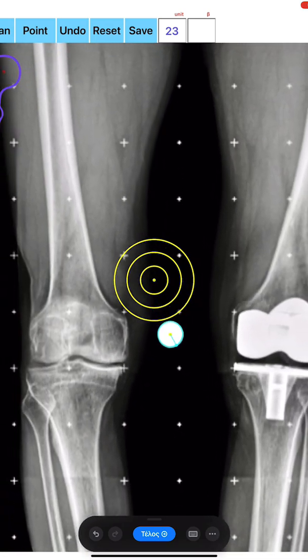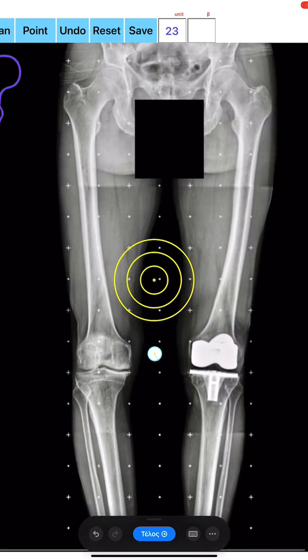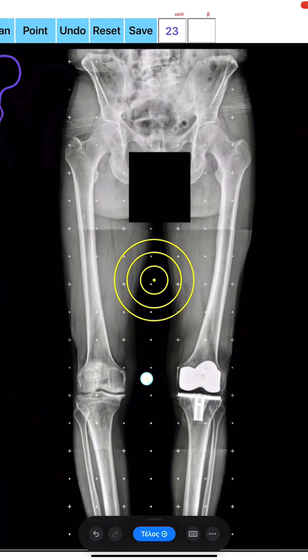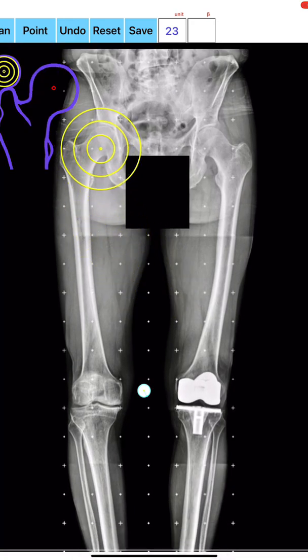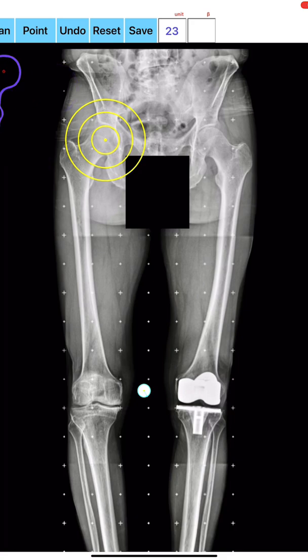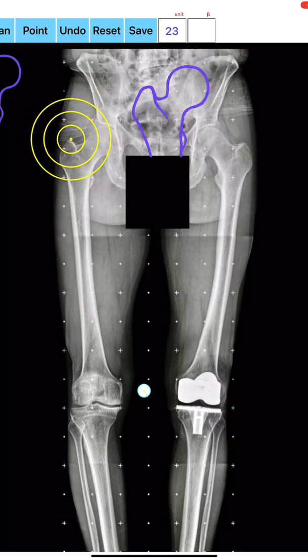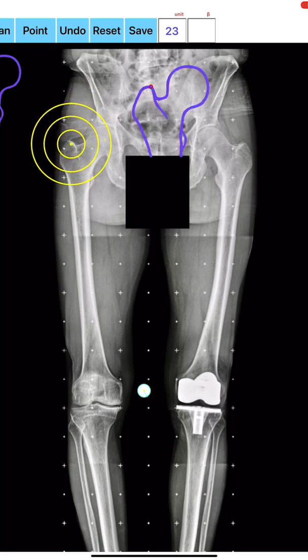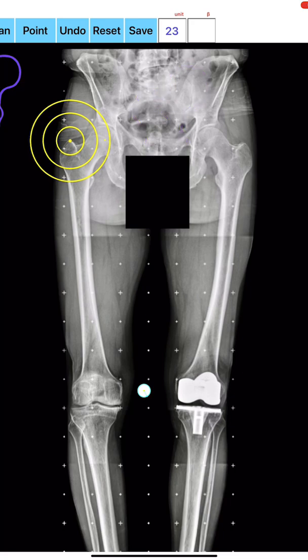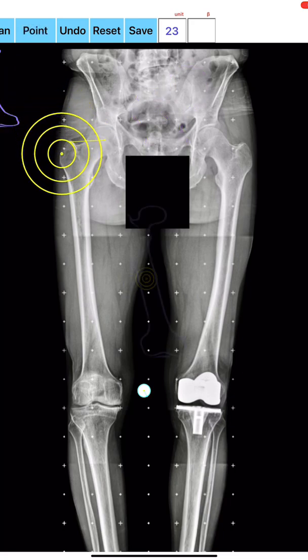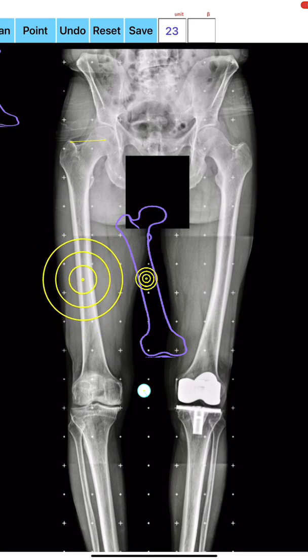Next, with the transparent circular template, the user aims to locate the center of the femoral head. By fitting the best-fit circle to the contour of the femoral head circumference and clicking the point button, the center of the femoral head is marked P1. By the same manner, the medial side of the tip of the femoral great trochanter is marked P2. Likewise, by aiming at the intramedullary femoral canal, the center is marked P3.